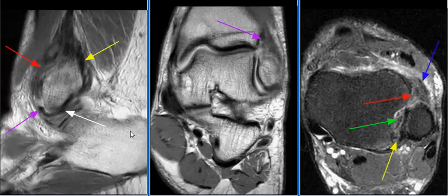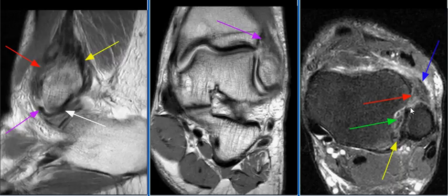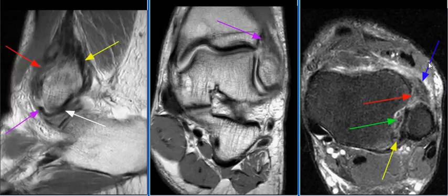MRI examination shows chronic tear and extensive scarring of the anterior syndesmotic ligament, as seen on this image with the red arrow. There is proliferative synovitis extending into the anterolateral gutter, as seen in this image with the blue arrow. The presence of scarring and proliferative synovitis in the anterolateral gutter is consistent with anterior syndesmotic impingement.